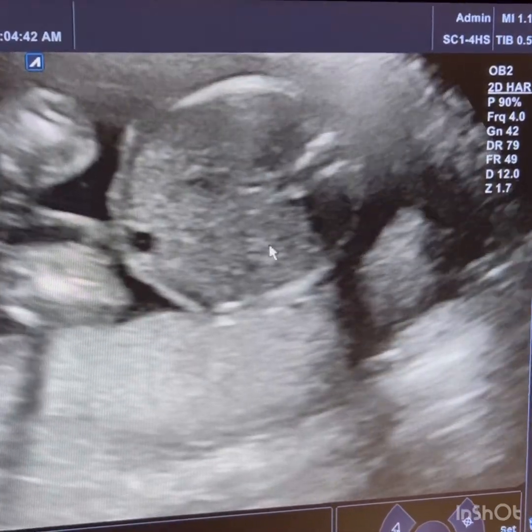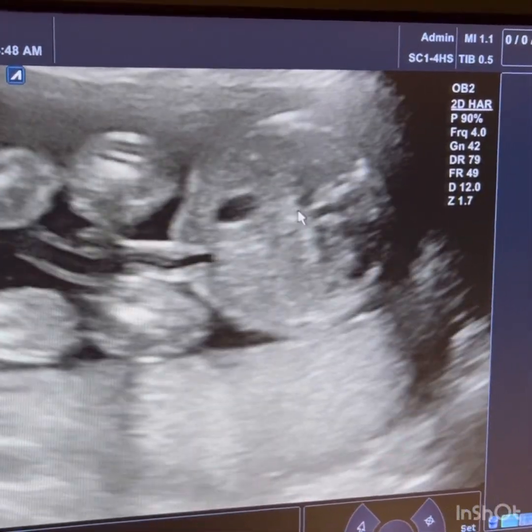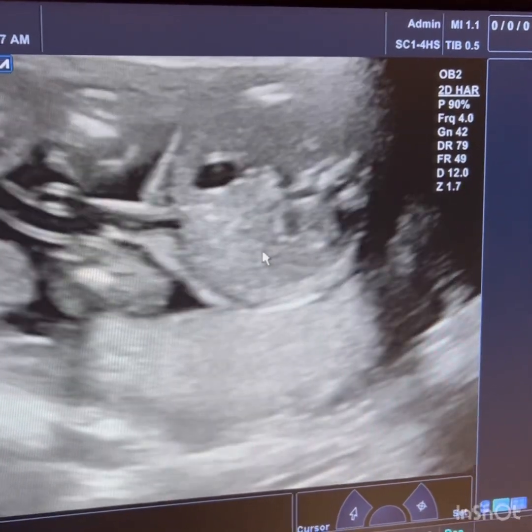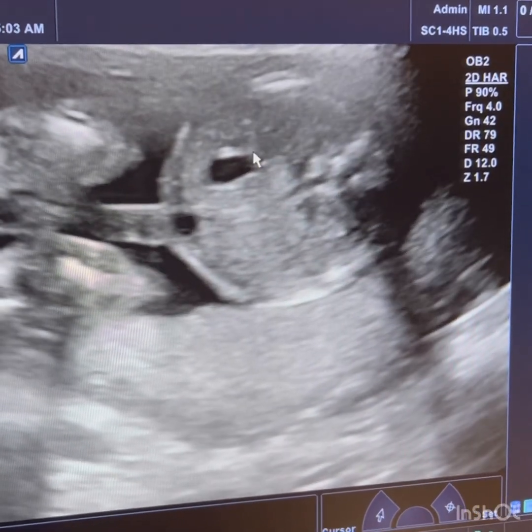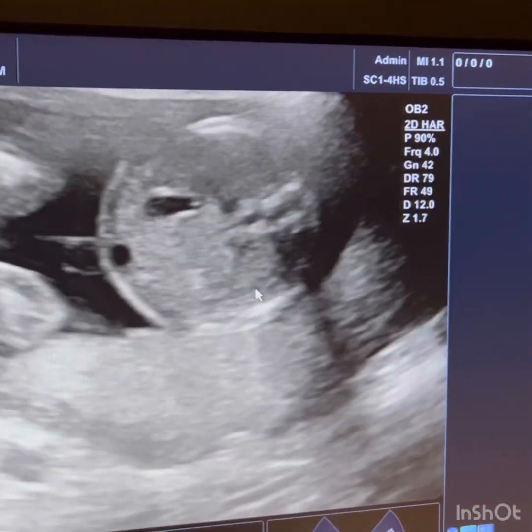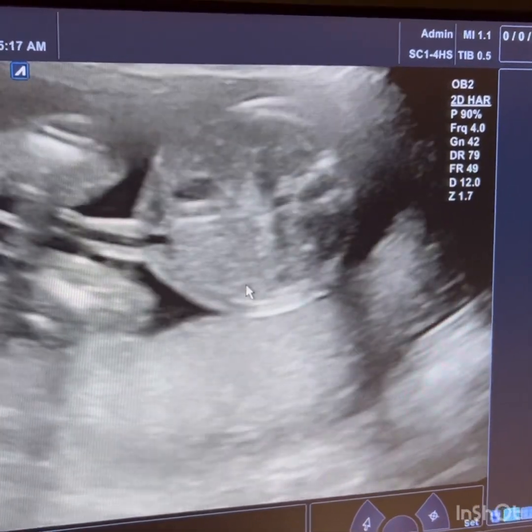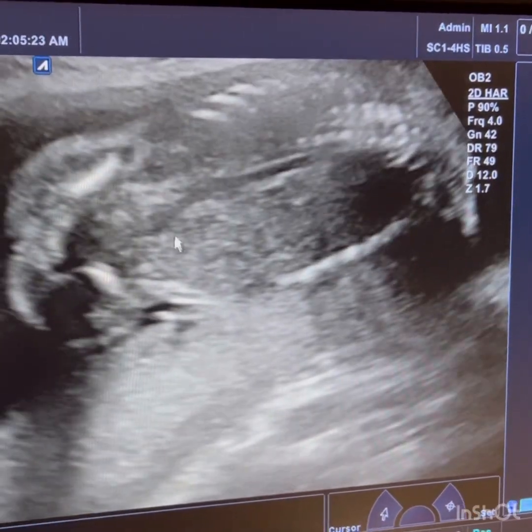Again, I should emphasize that our exam should be at least 20 minutes long, and we should wait for the probable contracted stomach to be distended. So we have the gallbladder here, more anterior and far from the right kidney, and adjacent to the left kidney here, we do not see the stomach. Here is the left kidney, but adjacent to it there should be a stomach, but no stomach is here.